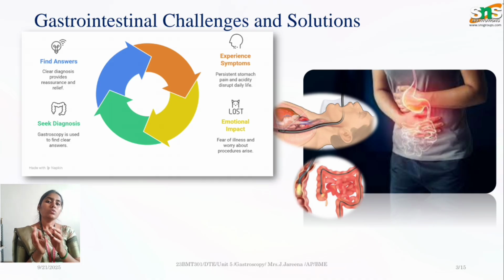imaging reports. So there are certain cases where there is a high need of a technique like gastroscopy to visualize the internal problems under the abdominal cavity. Here gastroscopy plays a very important role to identify the problems and to see the texture of the stomach organs. By means of that, the doctors can easily relate what type of problem is there, and they can give the treatments accordingly.